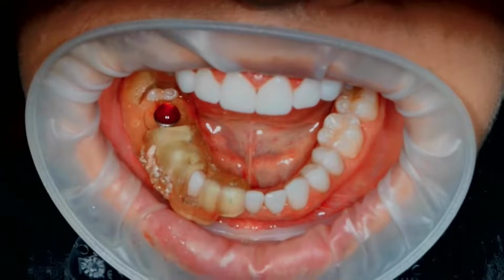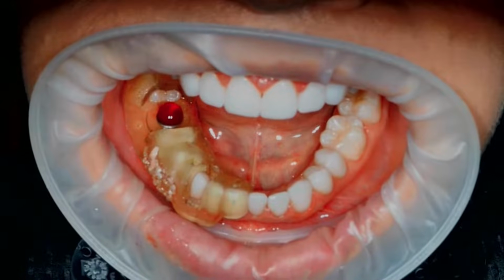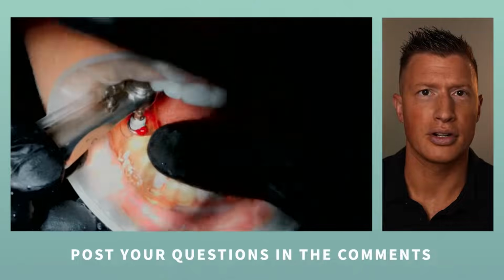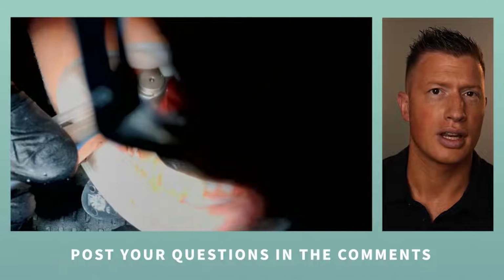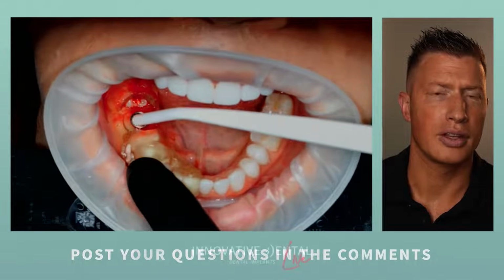Now it's time to go ahead and put the implant into that site. What I'm doing right now off screen is attaching the connection to the implant. And there's our implant. You can see me going there with it, and I'll back my head out of the way, hopefully. And I start driving that implant in place. There we go. And then I'll finish it up with a torque wrench.